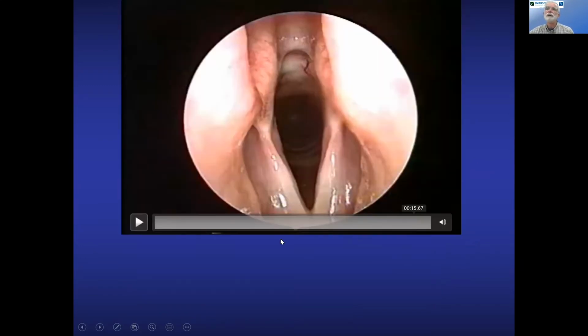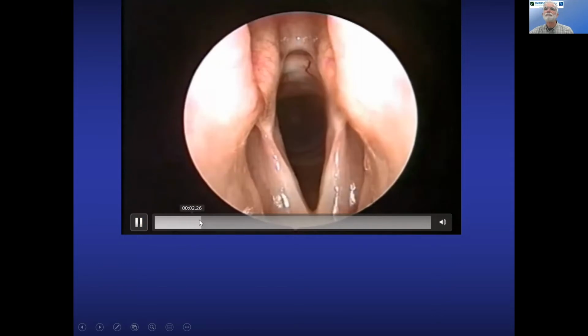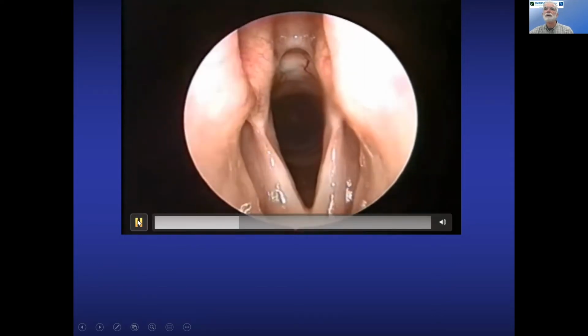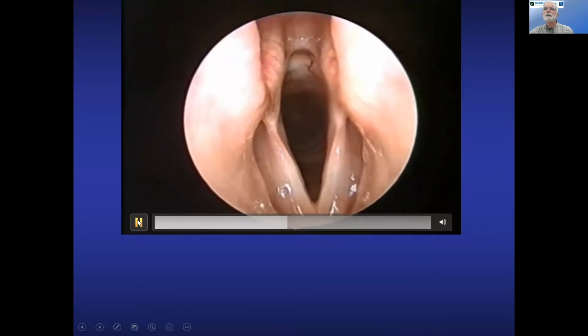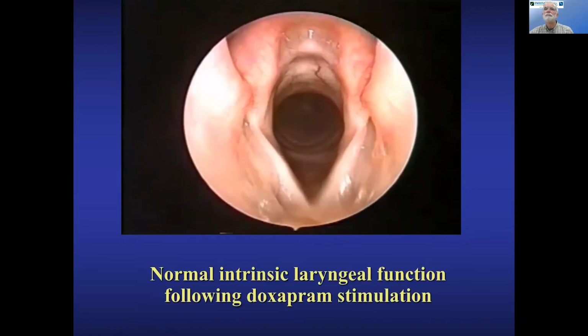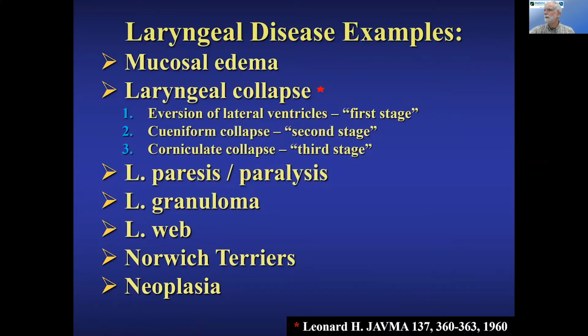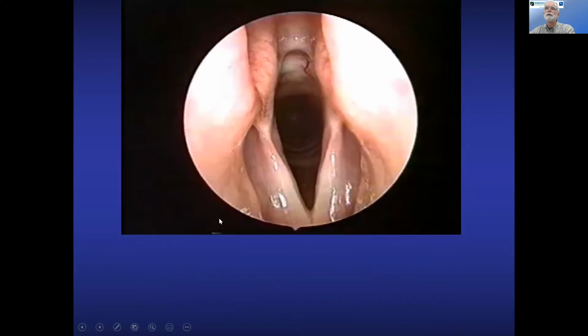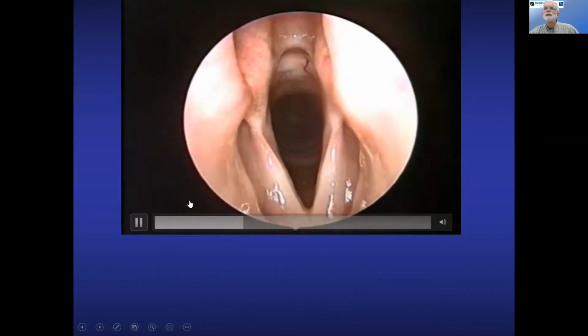So this is going to be a dog. You take a look at it. We'll try to let it start here. Doxapram's been given. Just trying to watch what's going on. Oh, the right side there moved a little bit. I stopped it. I started again, moving a little bit more. Good. Okay, now, come back. Sorry about that. Oh, we lost ourselves here. Let's go back. There we are. Sorry about that, folks. We'll just let it run all the way through.